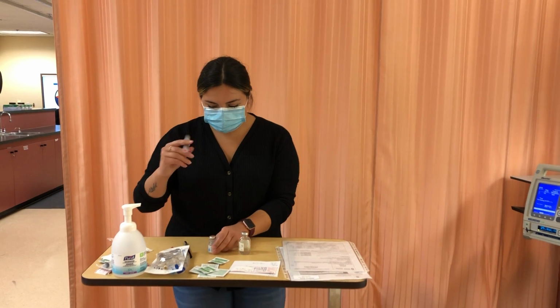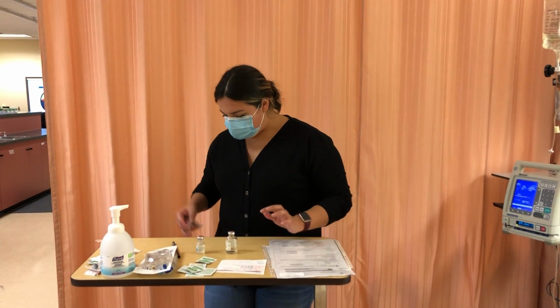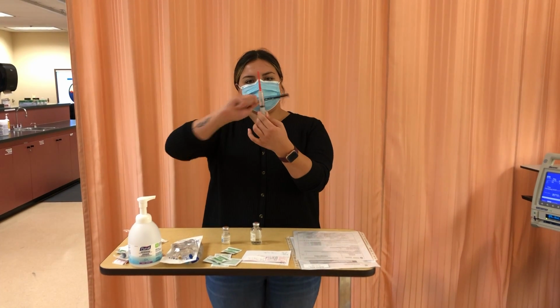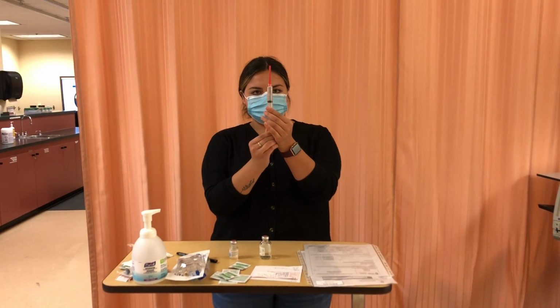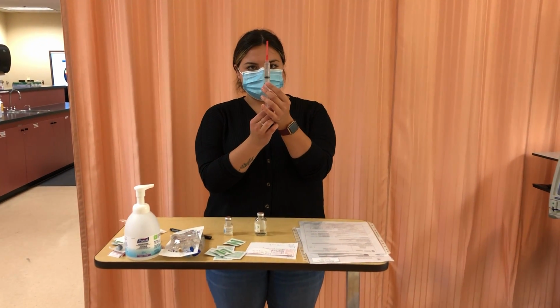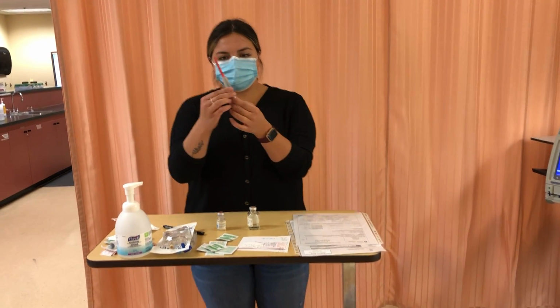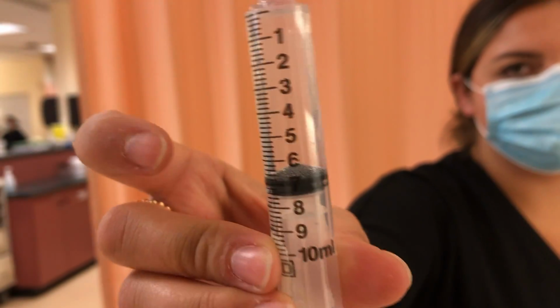So 6.8 milliliters here. Recapping. Ensure that I have no bubbles. Correct dose. So I have 6.8 milliliters of sterile water, no bubbles.